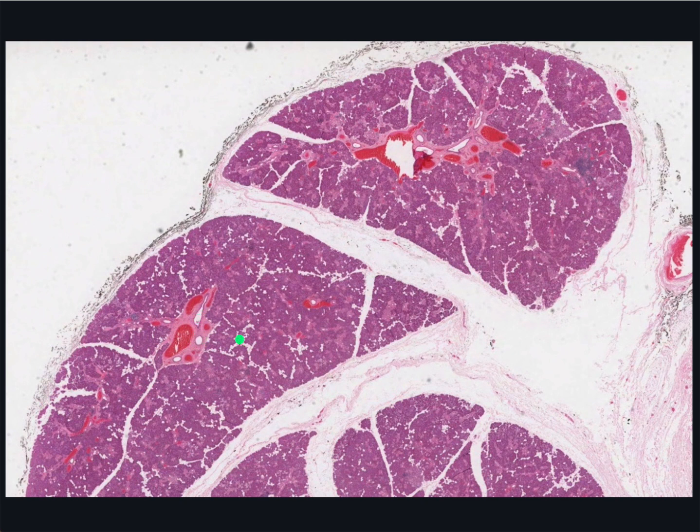The many aggregates of round, open spaces you see here are scattered fat cells. Fat cells happen to be a characteristic feature of the parotid gland. Connective tissue divides the gland into lobules of various sizes. To show you more details, I'm going to zoom in to this region here.